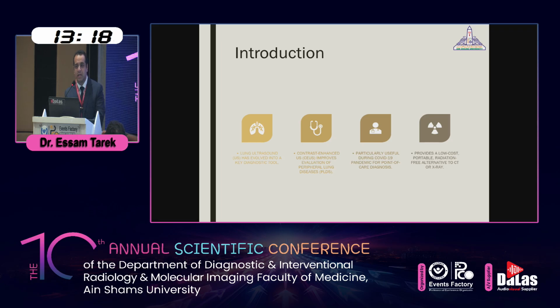If you remember what happened during COVID, most of us, as clinicians or radiologists, rushed to do a CT exam first to diagnose the patient or even to triage the patients. This led us to a lot of unindicated CT scans, and we exposed patients to a lot of radiation dose, which was not the real need. So that's why we tried to figure out if there is another modality that we can rely on. From that, ultrasound, either conventional or contrast, started to evolve at that time.